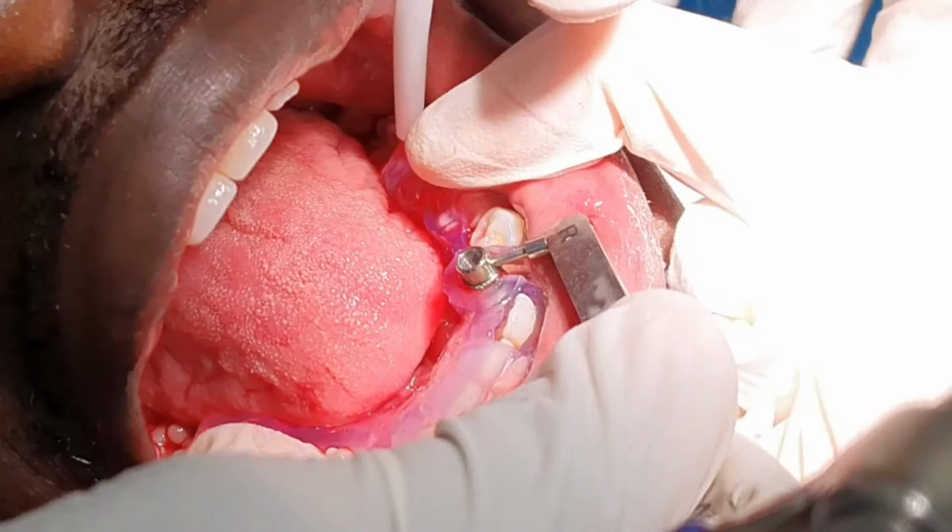So again, we're going to place the template. Now in between drilling, if at all possible, do not remove the template. There's always a possibility that you might not get it in exactly the right place. Maybe there's some swelling occurred or some other such thing that might prevent you from placing it. So if you keep the template in the patient's mouth, it's not particularly large or uncomfortable for the patient, so it's best to leave it in situ.